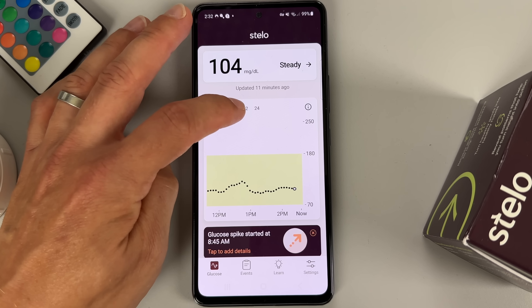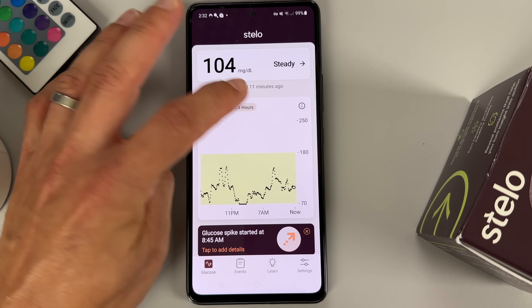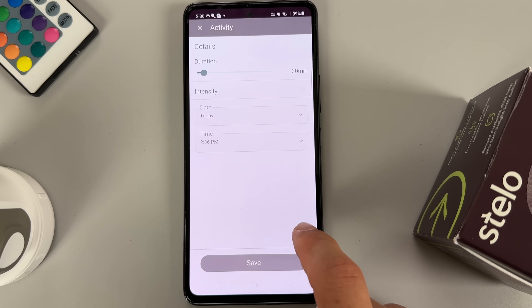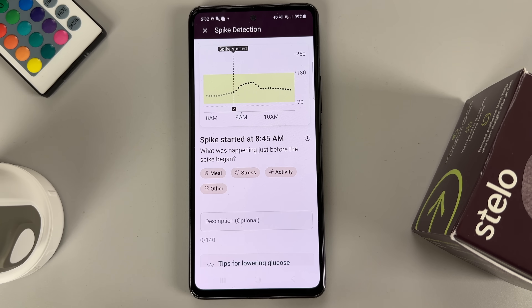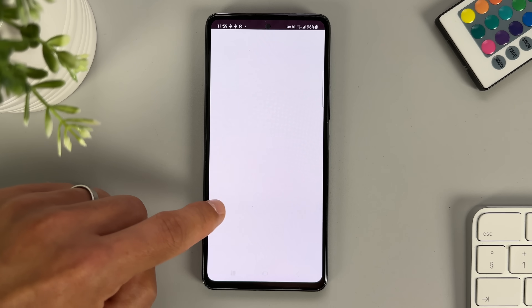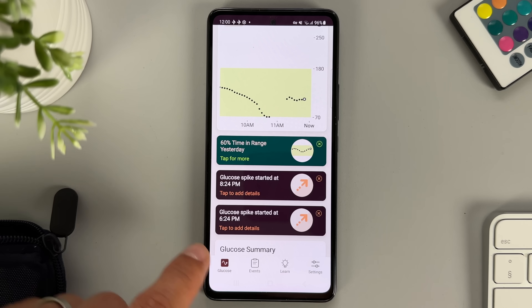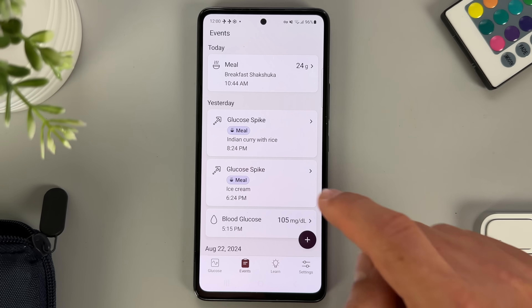Now that the 15 days are over, let me talk about what we liked about the Stello and what we didn't. The main benefit over finger pricks is that with the Stello app you get a constant 24-hour view of your blood sugar — not just point-in-time readings. You can also track events like meals, exercise, finger pricks, or others right in the app. But the one feature we found most helpful is called spike detection. It identifies significant spikes in your blood sugar and gives you an option to track what happened before each spike started. When you do this, the app will remind you that, for example, when you eat ice cream your blood sugar will spike. By reviewing the glucose spike triggers — be it food or stress — you can uncover what works for you and what doesn't.